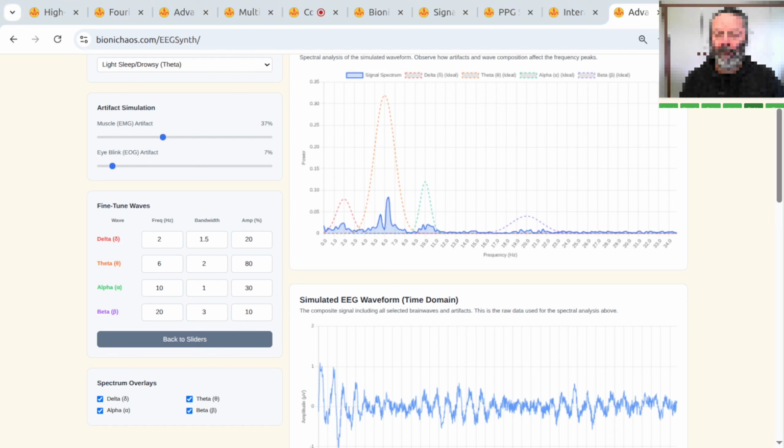Oh, the applications are really transformative. Take epilepsy. EEG is standard, but new frameworks using deep learning, like 1D CNNs with LSTMs on EEG data, are achieving really high seizure detection accuracy, sometimes over 96%, even with just a few channels. That's huge for patients. Better, faster diagnosis.